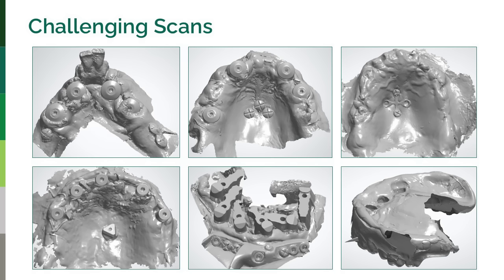Scan bodies, suture caps, healing collars, repeated same shape items that confuse the scanner, and then to add in a couple of screws back in a retromolar pad, or 3 up there in the top left. You can see that image. We're scanning a denture 360, predictably, right? So there's all kinds of variables that we say can be overcome with this GuidedSMILE digital approach.